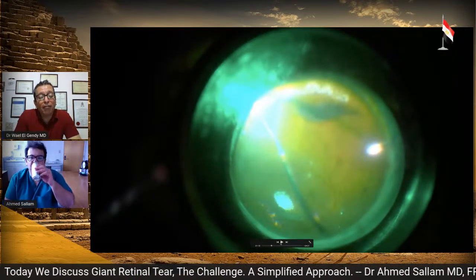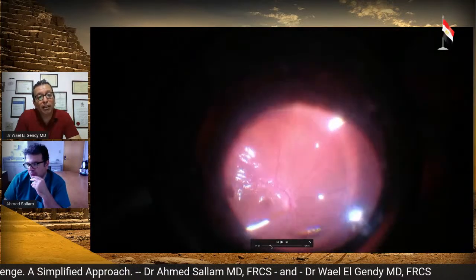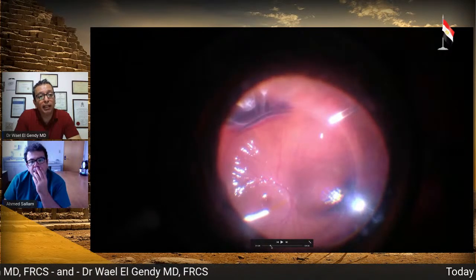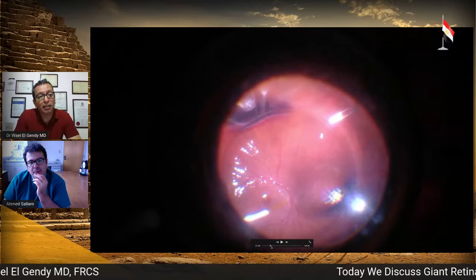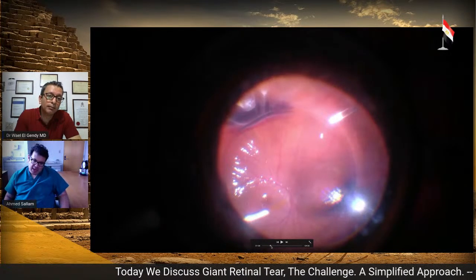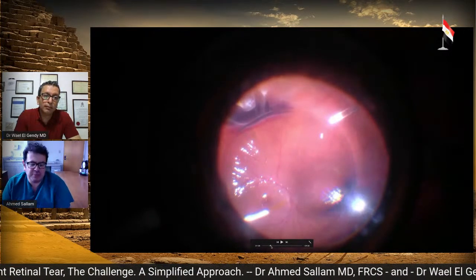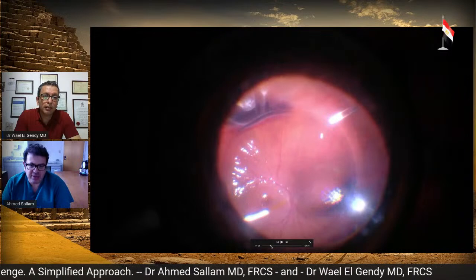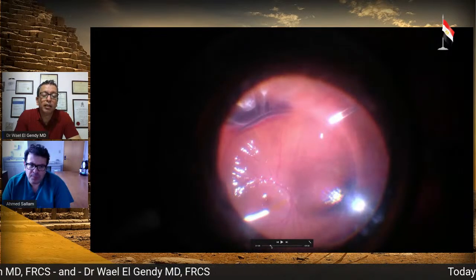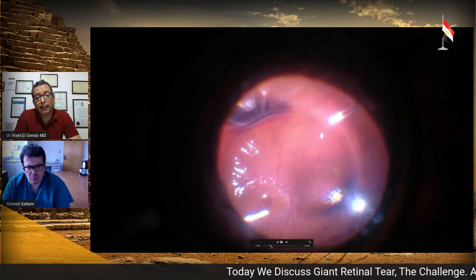So if you don't have the dual bore cannula, you use the 25 gauge in a 23 gauge system. Yes, especially if you have, and I think it works even with a valve, but I've never done that. I've just seen a technique article on it. We always have the dual bore. So yeah. Well, we don't have that readily available here with us.